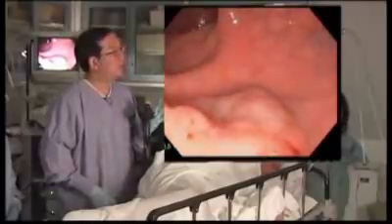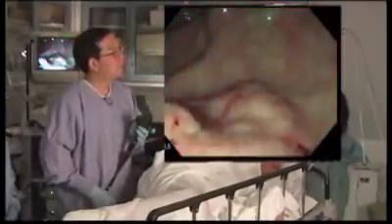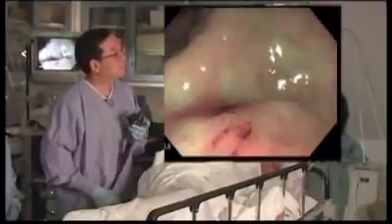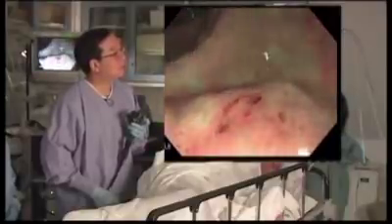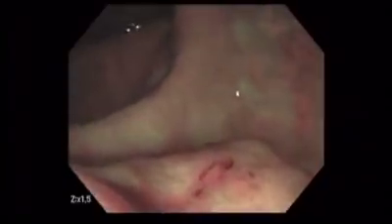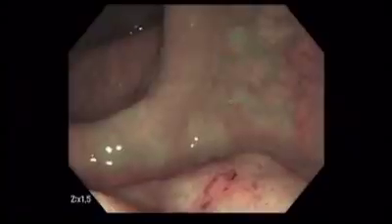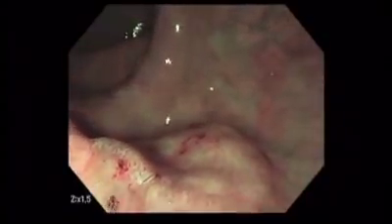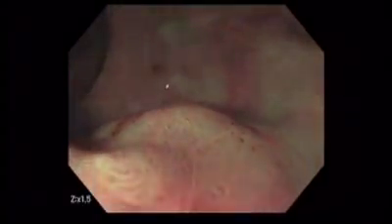Here we are about to deploy the NBI function. Again, the surface pattern can be closely examined.